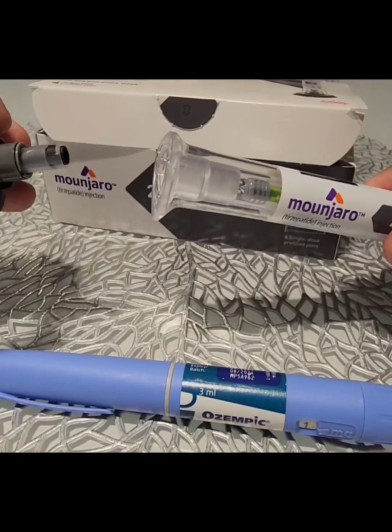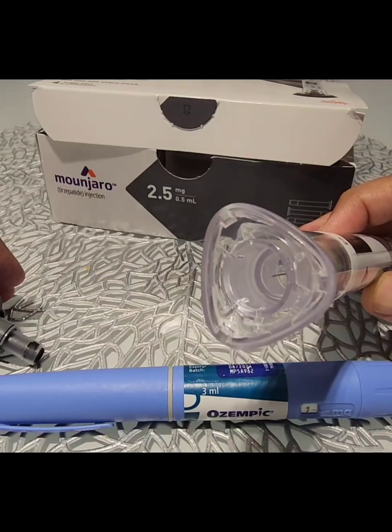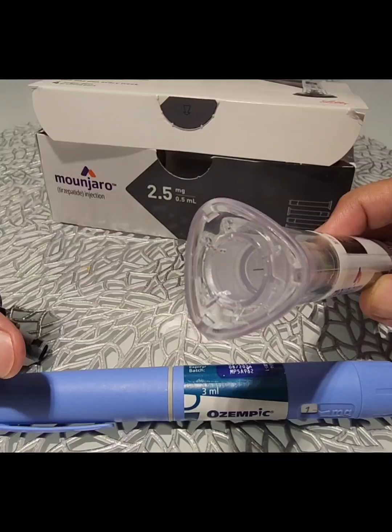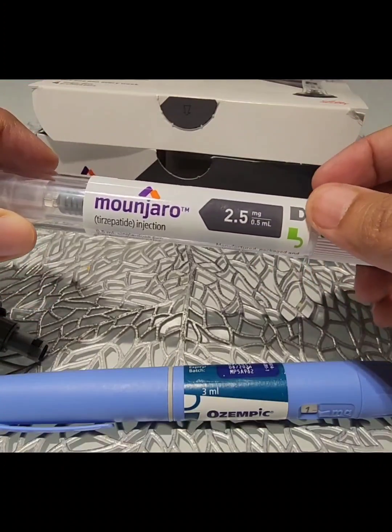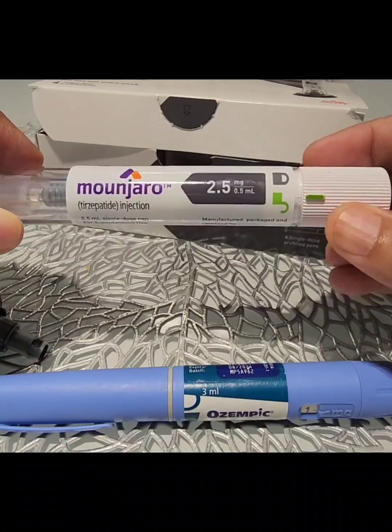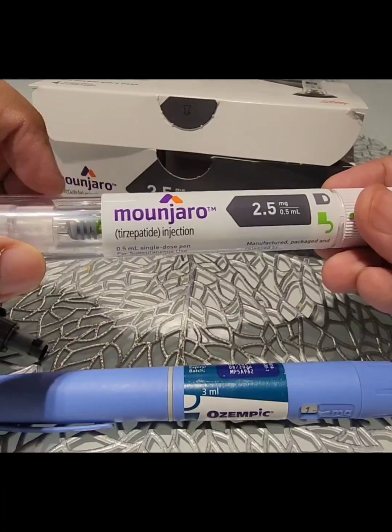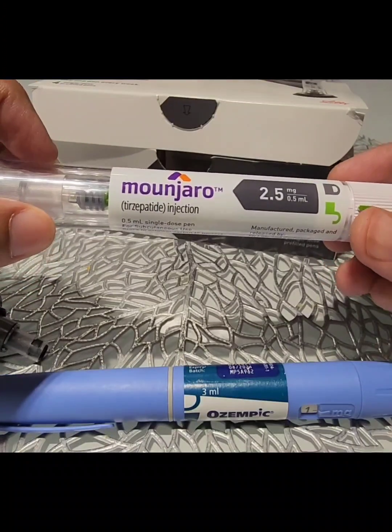There's no needle attachment required. If you open the cap, the needle is visible as you may be able to see here, but it does not need to be attached like we do on Ozempic. While administering this medication, there's a lock and unlock at the bottom — if you just unlock the pen and click at the back, the whole dose from this pen device would be administered. So this will be one week's dose per pen.